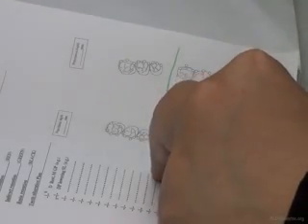What else do I do when I do cross-arch stabilization? What do I get more? I get more retention. And this is part of what they mean when they talk about equalizing retention on both sides. When we said that we need two clasps on one side, we should have two clasps on the other.